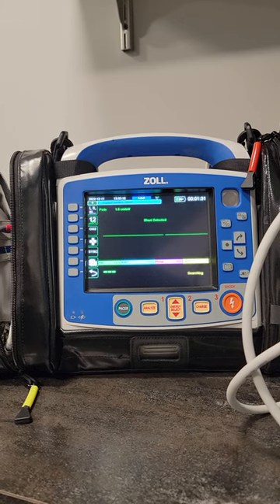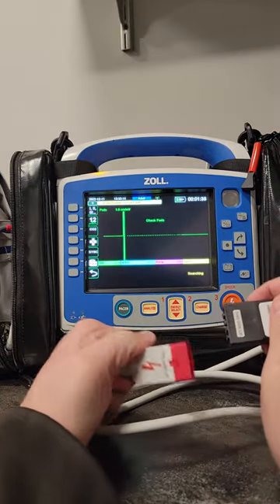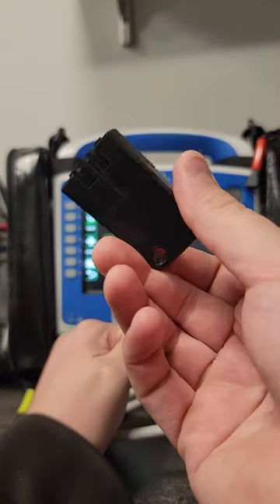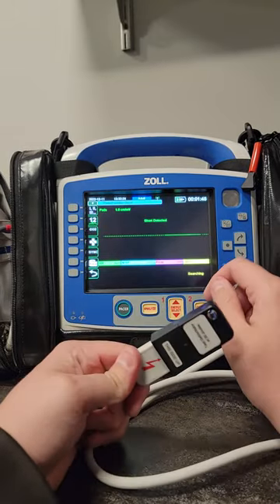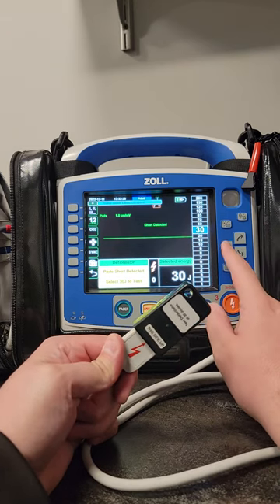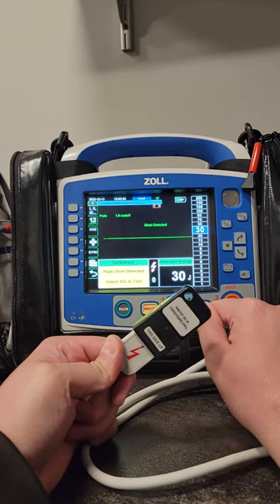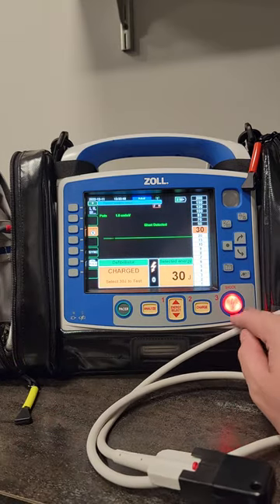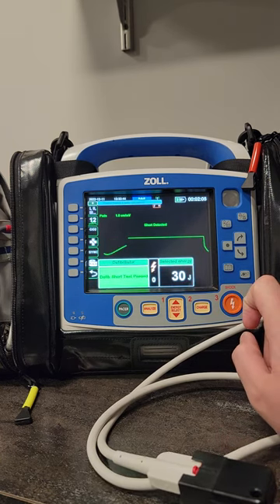On the Zoll series advanced monitor, to test it for your AED, you take this little device that comes with the monitor, plug it in, and then set the joules to 30. Hit charge — it's charging at 30 joules. Once you get the shock advice button, you hit shock.